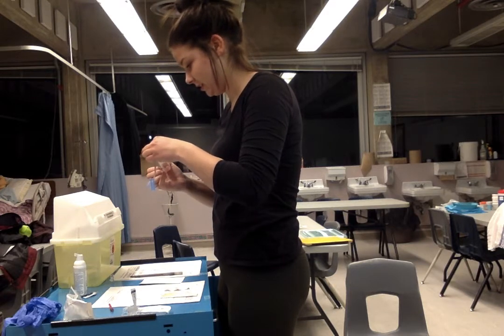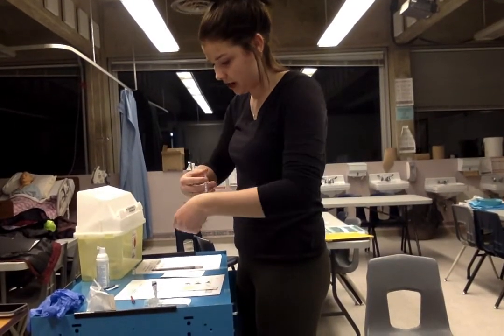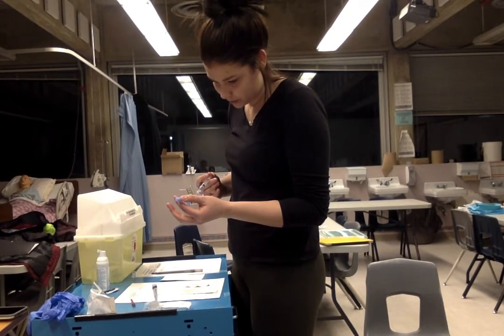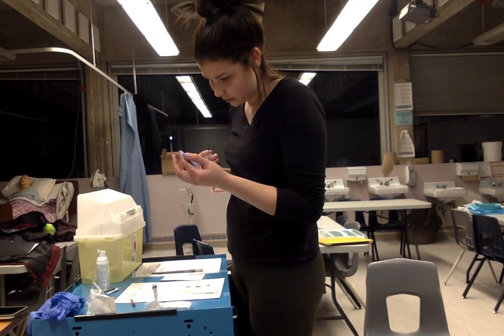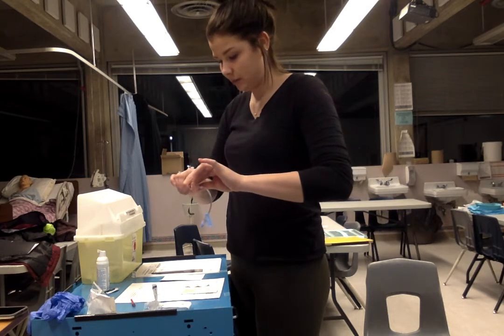All right, so now I will just prime the line. So I can see that my line is full now. And we have 0.4 mLs in the syringe left to waste.